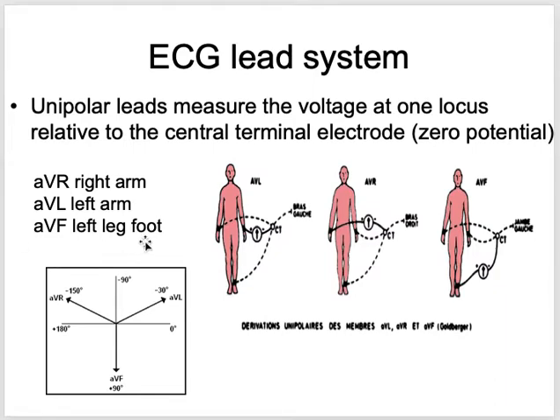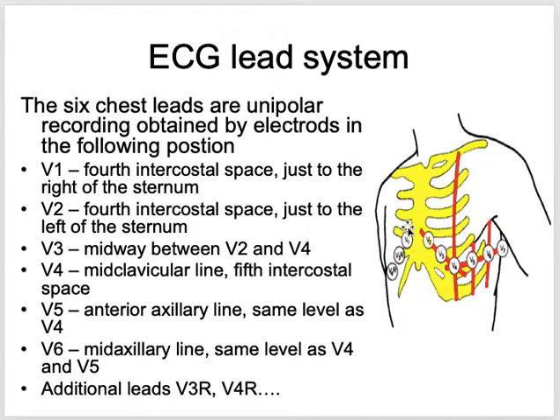Okay, I think this one will be understood later on. This is about the leads V1 to V6. There are additional leads also, V3R, V4R, which can be placed on the right side, but we are not going into that discussion right now because they are used only sometimes.